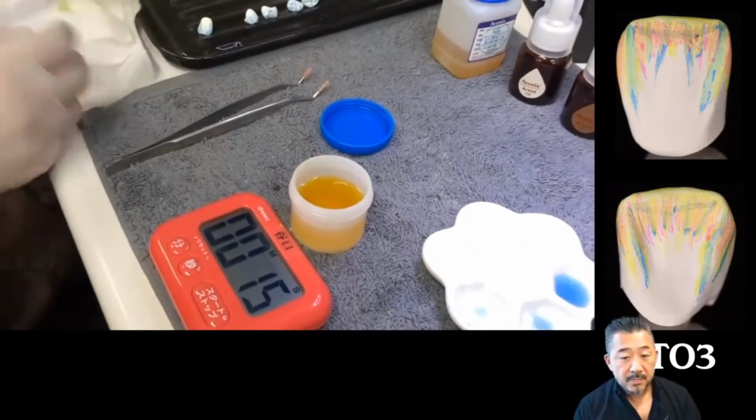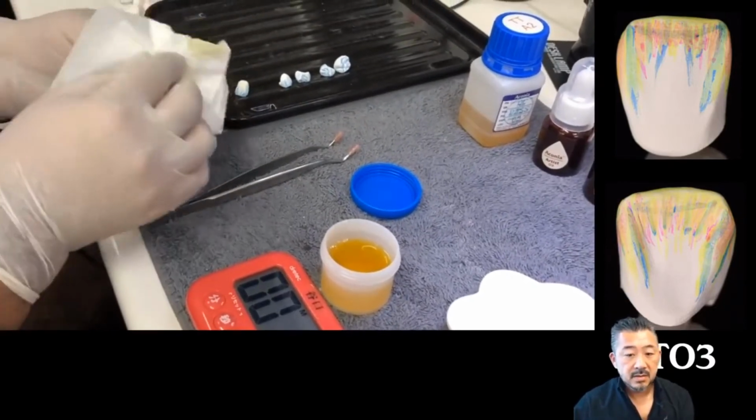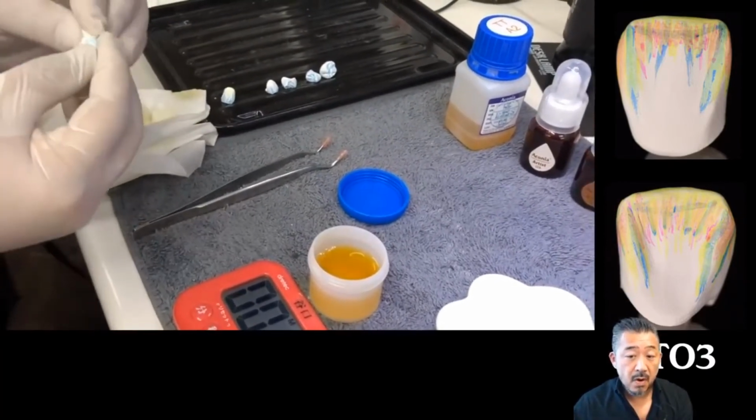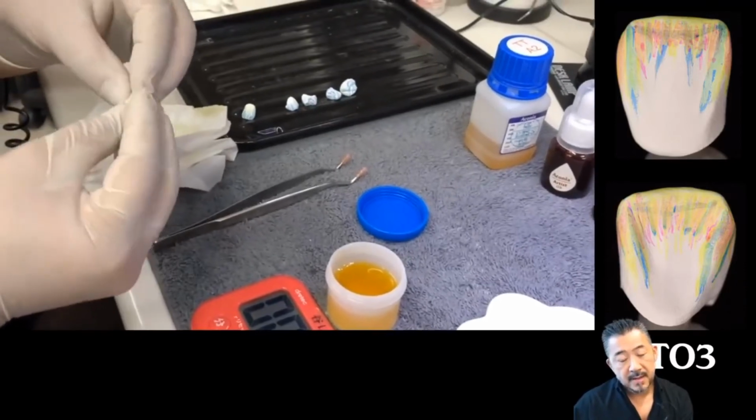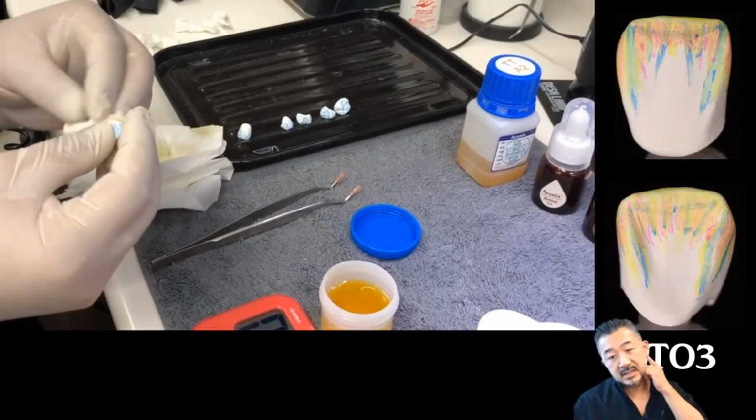Wipe off excess liquid after immersing. Repeat these 4 steps for all crowns. But as I said at the beginning, this is a required step only when using the TT white disc.